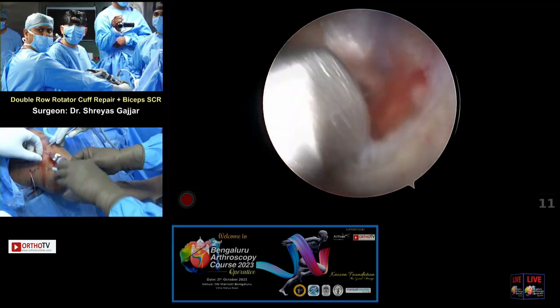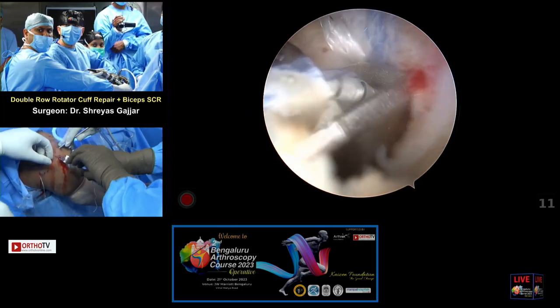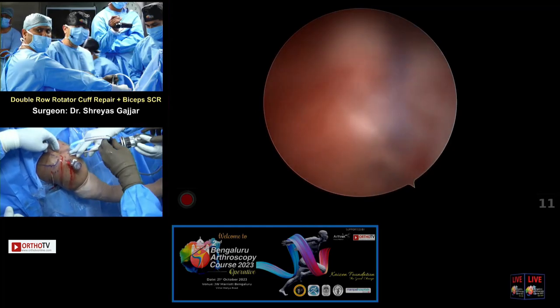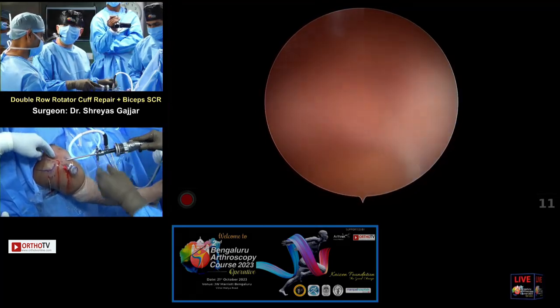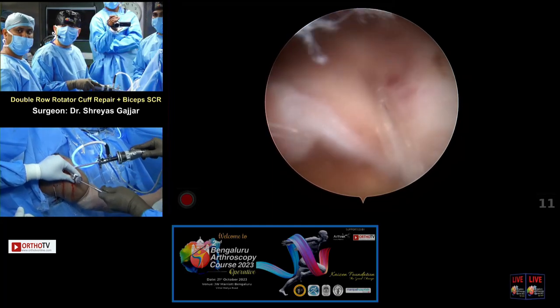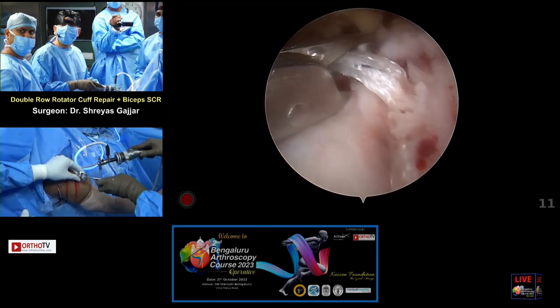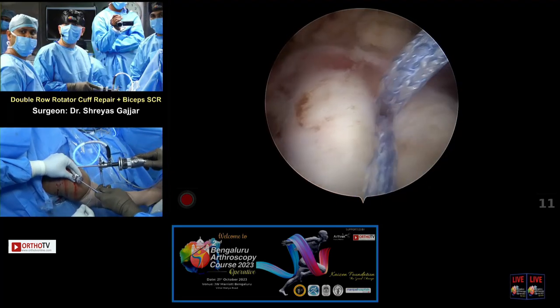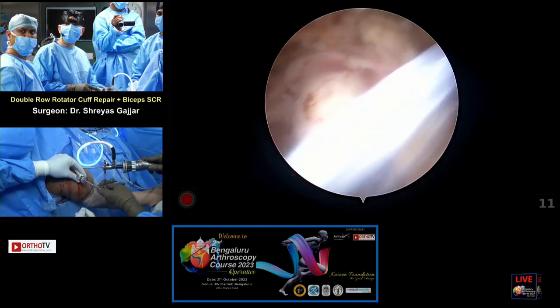Yeah. And then you just go flush and cut the tapes like so. And then we'll put the lateral anchors. Can I have the tape retriever, please, sister? Cannula, please hold the cannula gently. Yeah, very good. So now I'll just get these two tapes and do the lateral thing. Can you hold the tape, please? Yeah, fantastic. And then the second one.